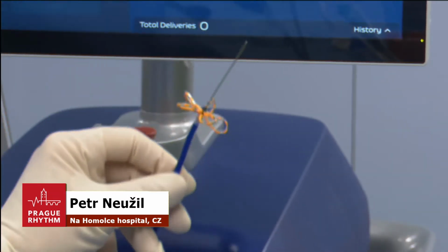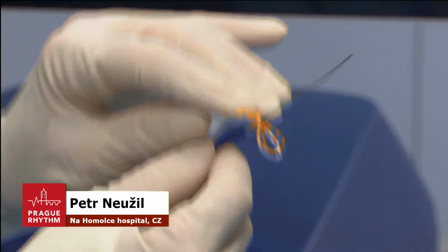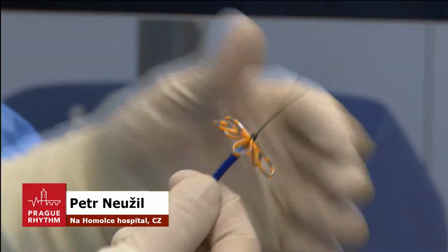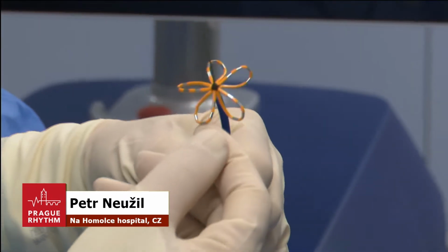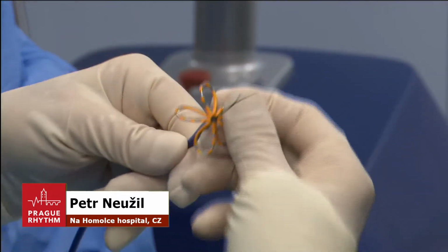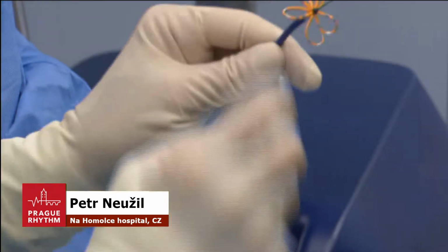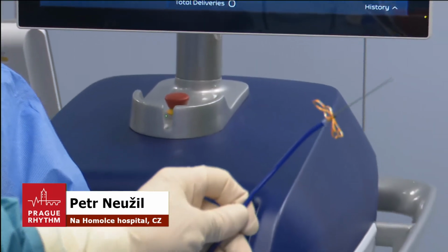From this shape, it goes to the flower position, the flower form. It's very good to adapt the splines, but there are 5 splines with 4 electrodes. It's good to shape the catheter to fit the PV ostia. So this is about the catheter itself.